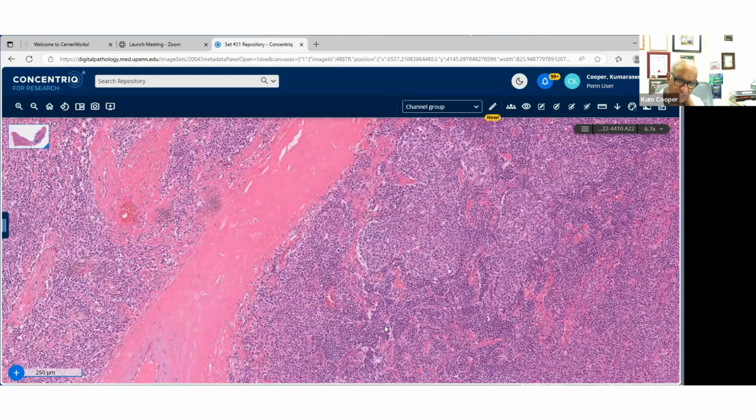And of course, CD21, CD23, CD35 confirming that diagnosis. For many years, that's how it remained, that these were described in the liver and spleen and always formed the differential diagnosis of inflammatory lesions of the liver, which would include things like IgG4, syphilis, et cetera. But this is one of those that you have to think about. I remember many years ago asking John, well, how best would you identify these dendritic cells in this mass of inflammation? And he said EBV, that's the best marker. They light up, and that's how you make your diagnosis.